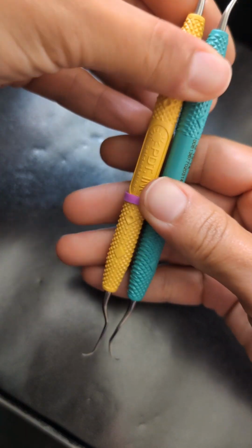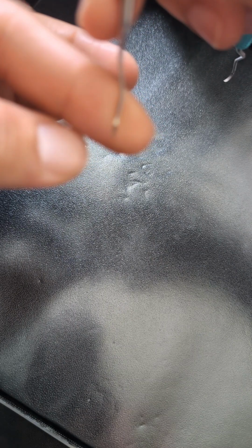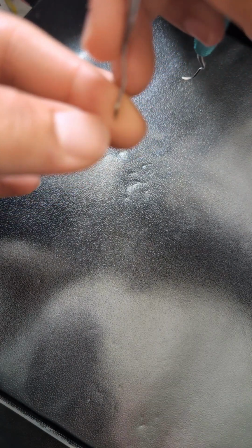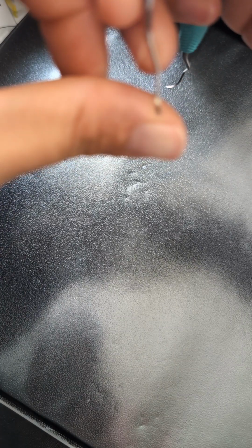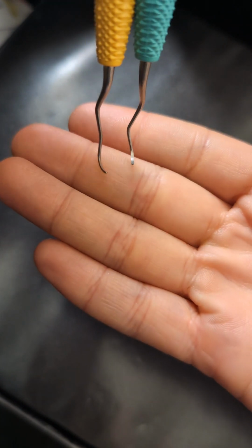The difference between the Gracey instruments and the universal, we can see in the lower shank. The parts of the instruments are the same: handle, shank, working end. The difference is in the working end; I don't know if you can see it, but the blade of this instrument is not angled 90 degrees like the universal. This blade is angled 70 degrees in relationship to the lower shank. Same with the 13-14 Gracey, 70 degrees in relationship to the lower shank.